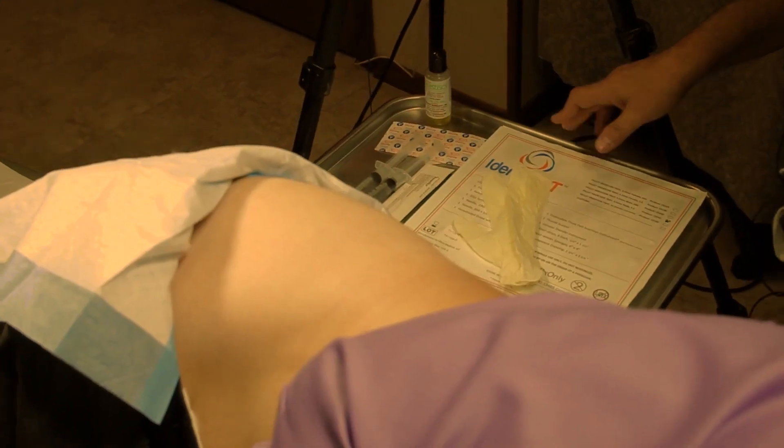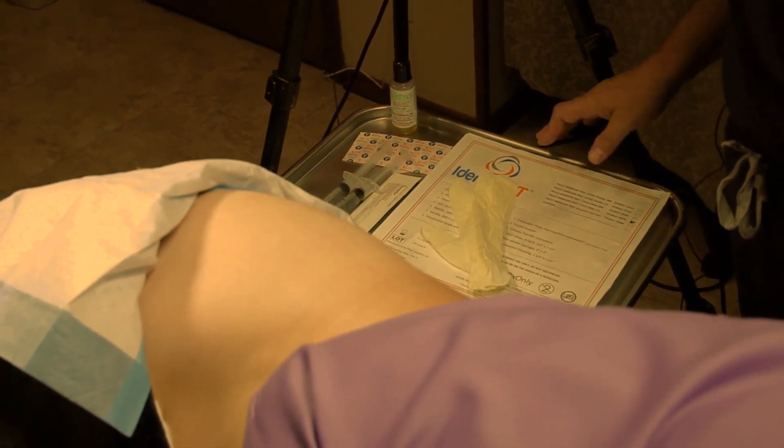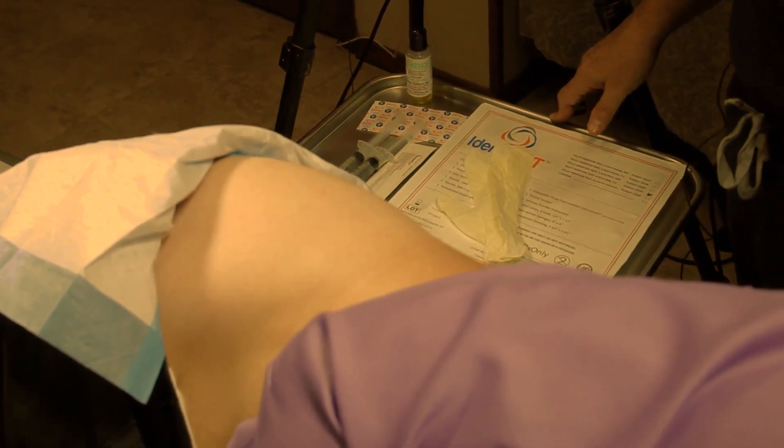This is Dr. Steven Seligman, and I have been asked by Pharmacy Solutions to demonstrate my technique for inserting hormone pellets in both men and women. The technique that I will demonstrate is one that I've evolved over the last seven years. This technique is very efficient, allowing you to do multiple patients in a single day. The technique I'm now going to demonstrate is for your male patient.